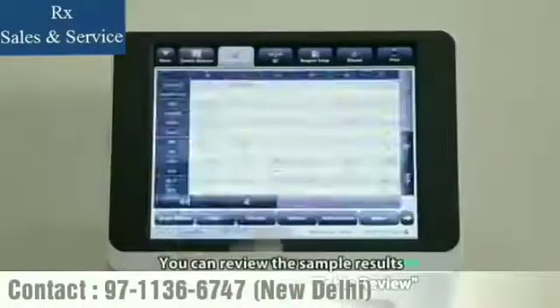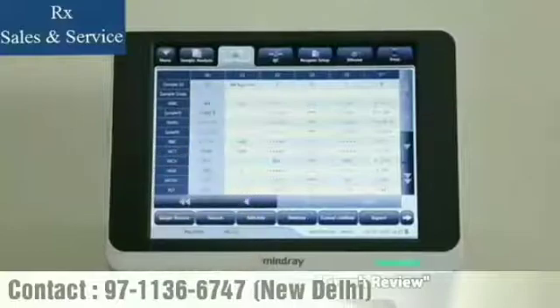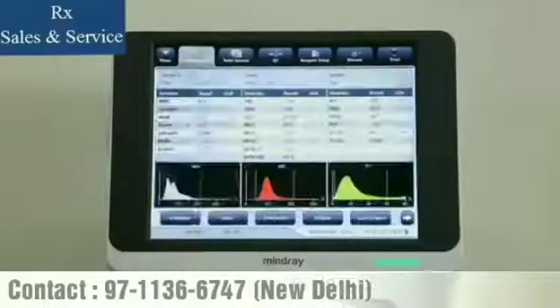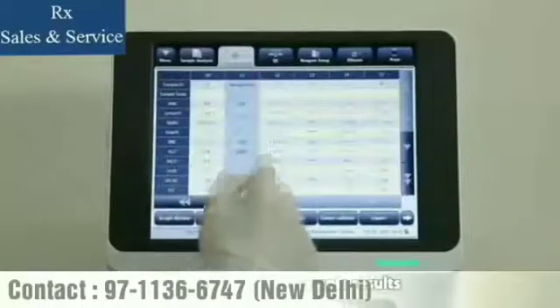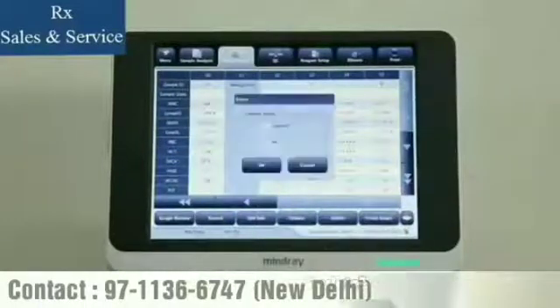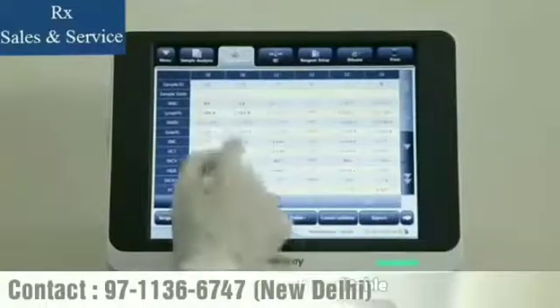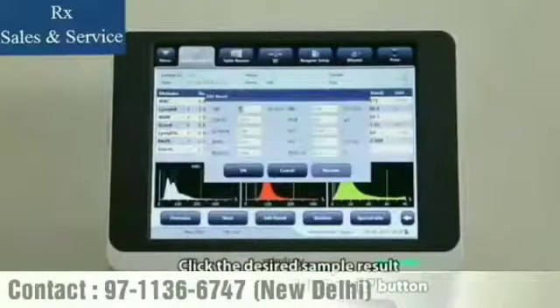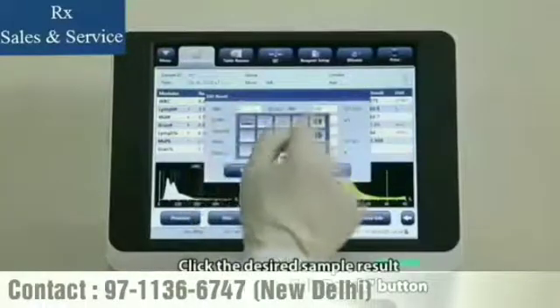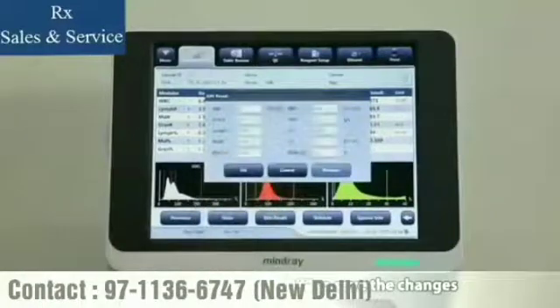You can review the sample results by table after tapping Table Review, or in graphs by tapping Graph Review. For unwanted sample results, select and tap Delete. Every sample result is editable — click the desired sample result, then click the Edit Result button. Modify the results and tap OK to save the changes.